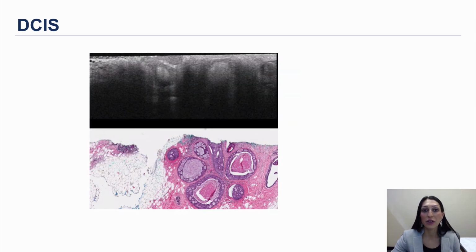This figure is looking at several dilated ducts with dense inner content. And this is suggestive of a solid type DCIS with central necrosis. The necrotic core of malignant ducts appear bright with surrounding viable epithelial cells. Again, this would warrant re-excision at this particular margin.